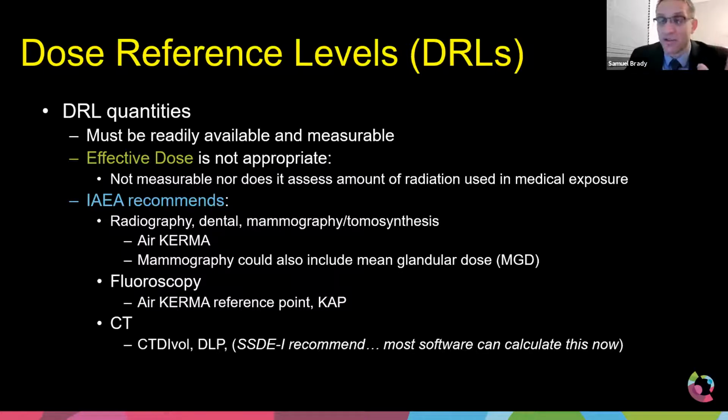But all of the dose tracking softwares do. So for example, when you guys do eventually install Radiometrics at various different hospitals in Thailand, it collects the CT information and it calculates SSDE for you. We'll talk about this when we get to CT, but as someone that works at a pediatric hospital where we image little neonates all the way up to very large obese patients, size is a very, very important factor to consider when we talk about radiation dose.